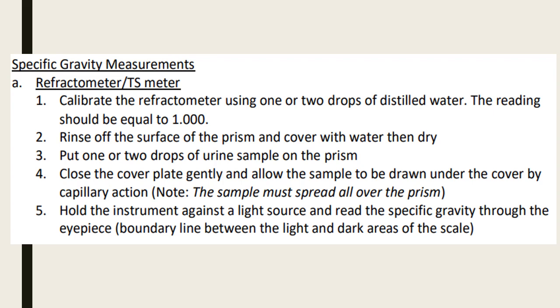While comparing it to your urinometer, you need to do so. Again, in your refractometer, you do not need to do corrections in the temperature of your sample, because it is calibrated between 15 degrees Celsius to 38 degrees Celsius. But you have other corrections, and we talk about this one in the lecture. So what are your corrections here?